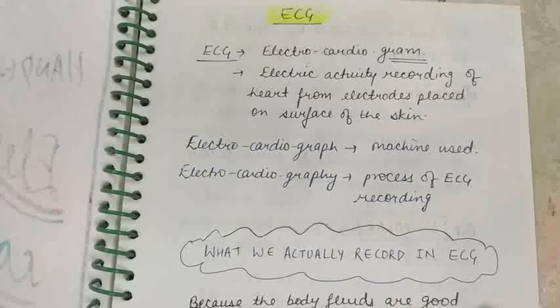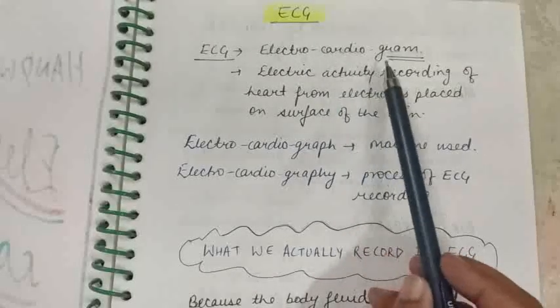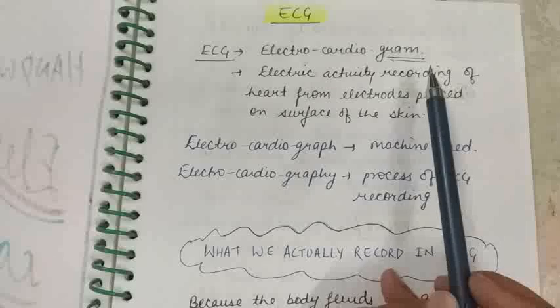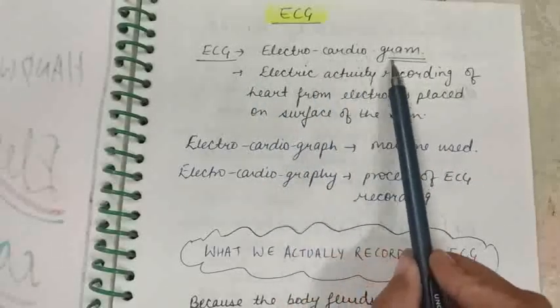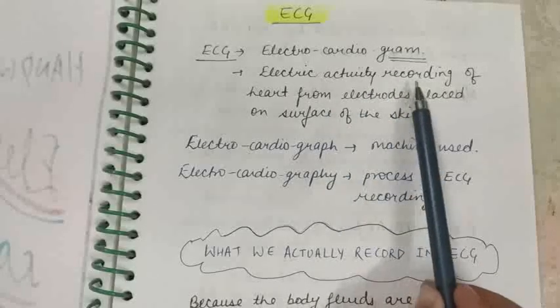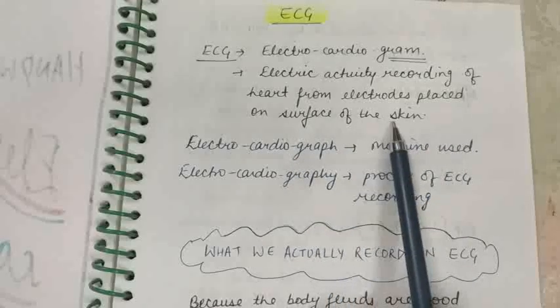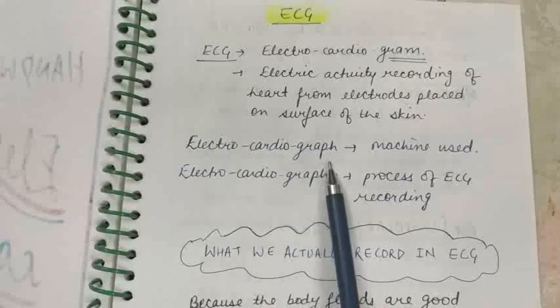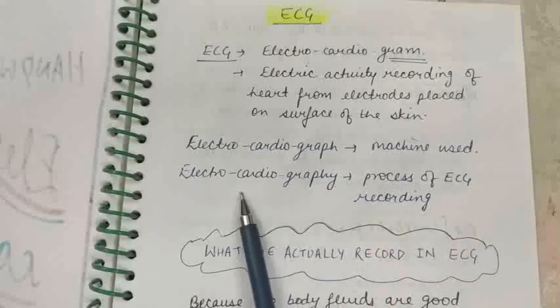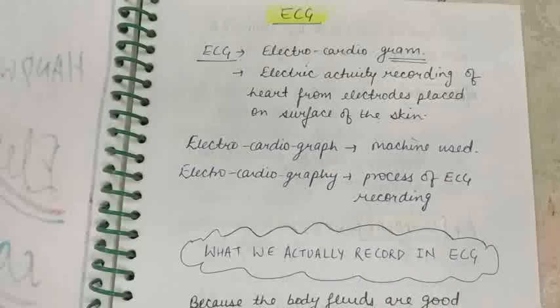Okay, so what is ECG first of all? We always get confused between electrocardiogram, graph or graphy. These are three things, okay? So we should know what ECG is here. ECG is basically the electrocardiogram, which is the electrical activity of the heart recorded by electrodes placed on the surface of the skin. But there is also electrocardiograph and electrocardiography. Electrocardiograph is the machine used, not the graph paper used, but the machine used, right? And graphy is the procedure of recording the ECG. Okay, so we'll be talking about ECG.